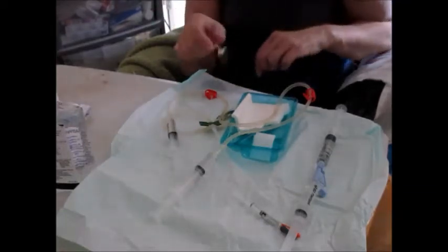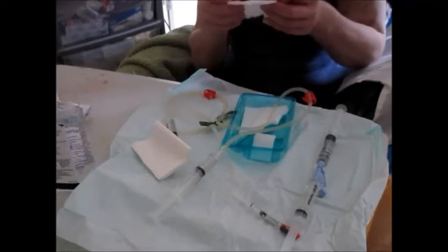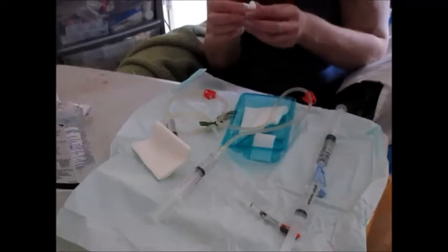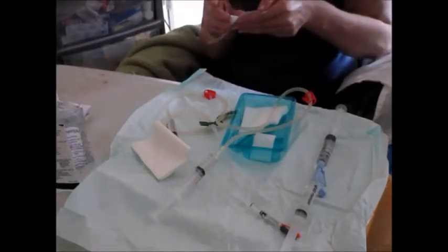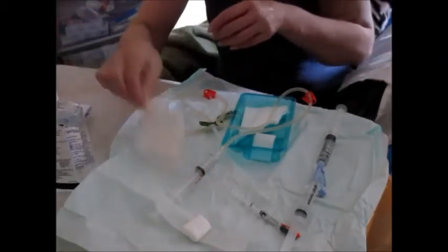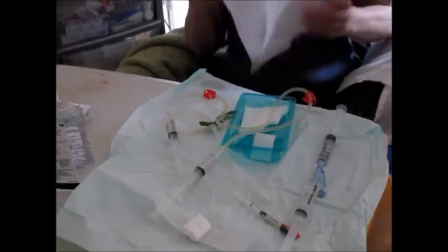I'm now going to prepare the swab that I may need should I have a problem inserting the needles, which I just pop on the sterile field. Then I'm going to cover over the table for a moment while I stop the video, and then I'll be back in a second.